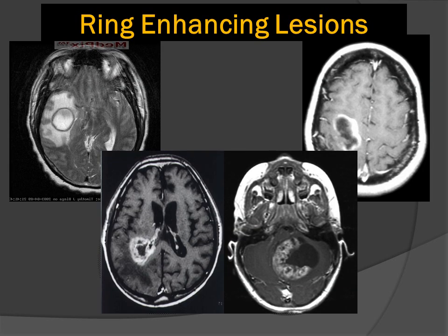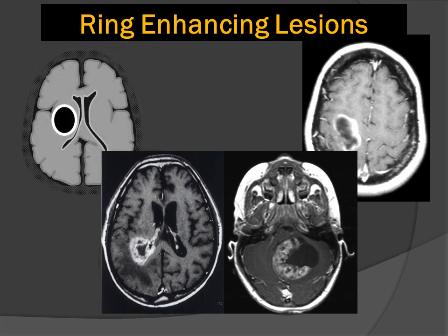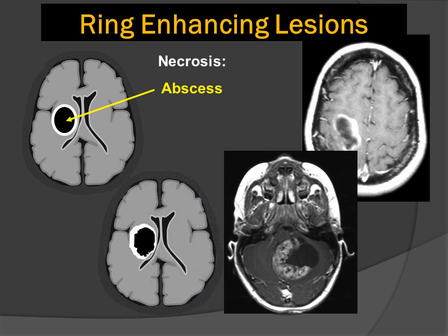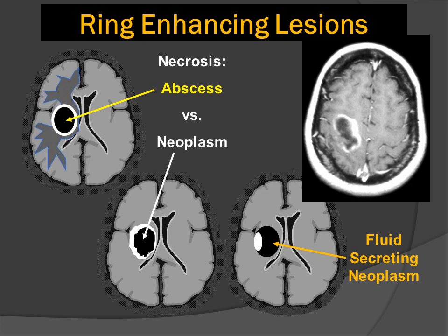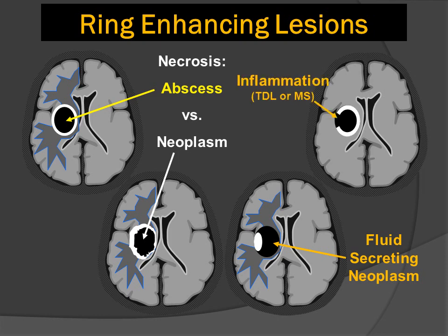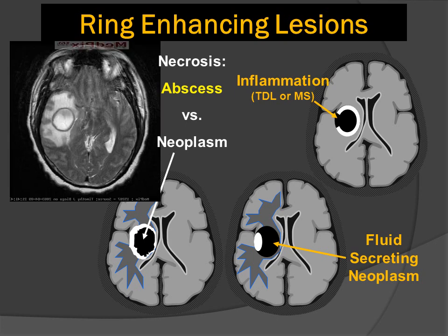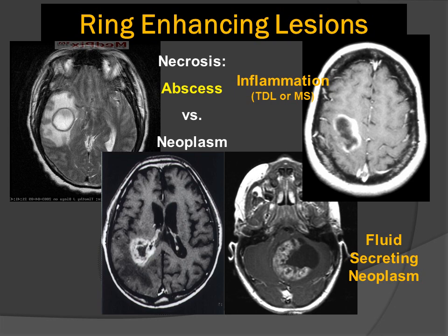Going back to the four types of ring-enhancing lesions: one is round and smooth, suggesting an abscess; one is very irregular with a shaggy inner margin, suggesting a necrotic neoplasm; one shows an incomplete rim of enhancement, often seen in fluid-secreting tumors, which can also produce the cyst and mural nodule morphology in the posterior fossa or cerebellum. We oftentimes see surrounding vasogenic edema with abscesses and neoplasms. When we have tumefactive demyelination, a critical feature is identifying an incomplete rim of enhancement, suggestive of an advancing zone of inflammation.